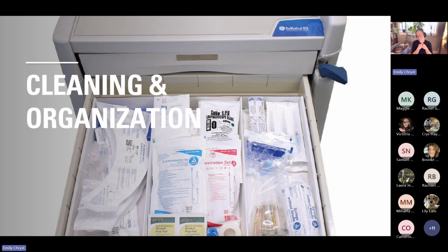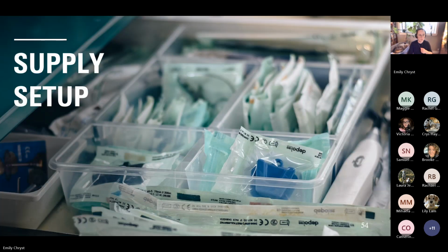And I'm a person that tends to be okay in clutter, not in these guys. Super organized, super set up. Because if I need something, I'm going to need it fast and I need to know exactly where it is. And I don't want to be running away from my patient to grab stuff a lot. I'm leaving my patient's side, and I don't like that. But also, I'm moving out of that safe, controlled ventilator area around a dirty ER or a dirty ICU, and then bringing all of that back to my patient. So we really want to minimize that as well.